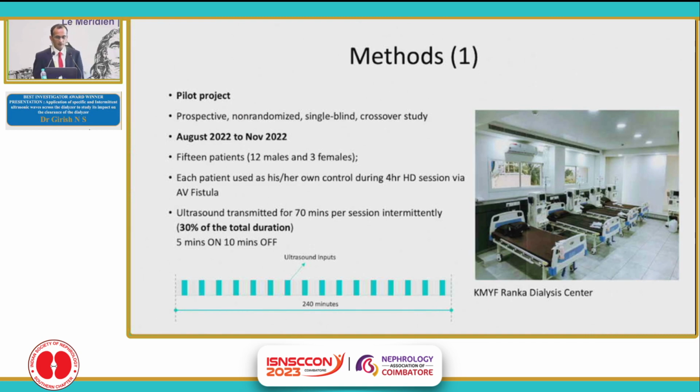Talking about the methodology, this was carried out in a 36-bedded isolated dialysis unit, which performs about 2,500 dialysis sessions. It was a pilot project, prospective, non-randomized, single-blinded, because the patient wasn't aware whether the ultrasonic waves were on or off. Subsequently we analyzed their quality of life questionnaire, which is an ongoing project. It was a crossover, so each patient acted as his or her own control during the 4-hour session. We had about 15 patients.